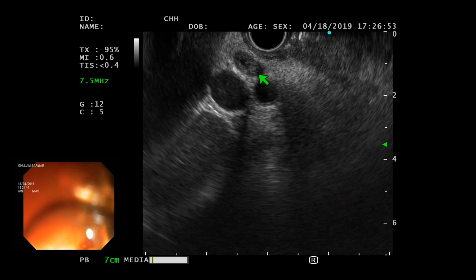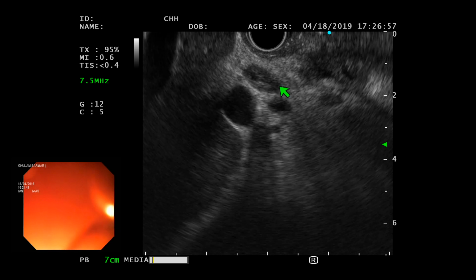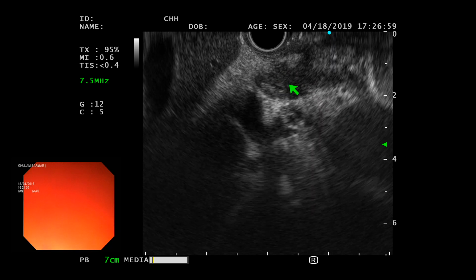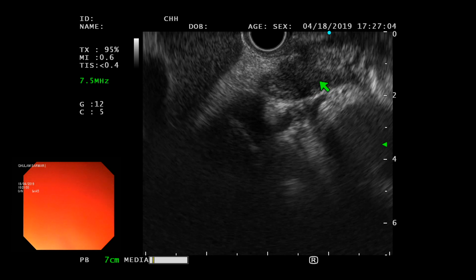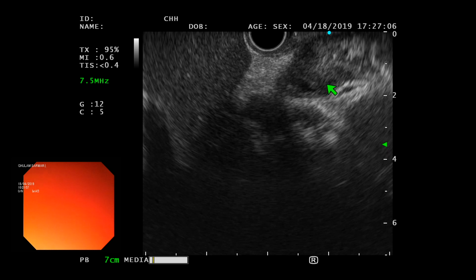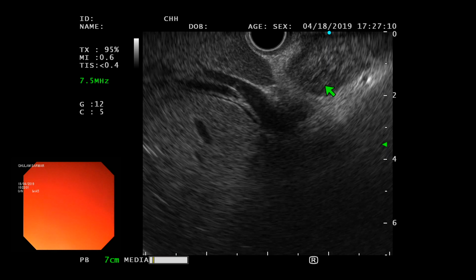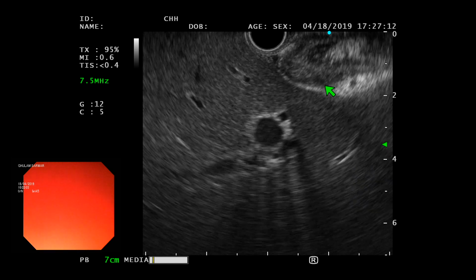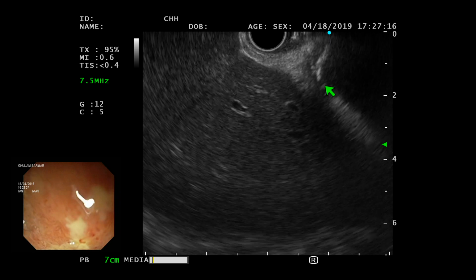It's quite thick. And with the sludge in there, now it's taking a shape more of a mass. Can you appreciate that? Yes. Okay. So when I follow that towards the gallbladder, I see there is some sludge there, and there is a huge stone in the gallbladder. You see that?